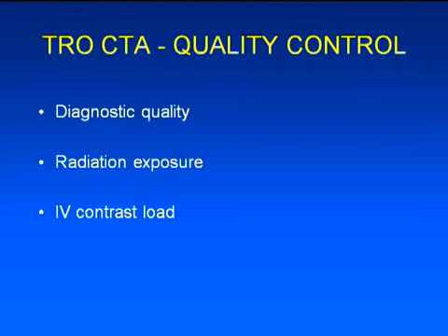So every time you're doing a triple rule out or any CT, you should have quality control to look for the diagnostic quality. Make sure the radiation exposure is kept as low as possible, and pay attention to the contrast load you're giving to also keep it as low as possible.